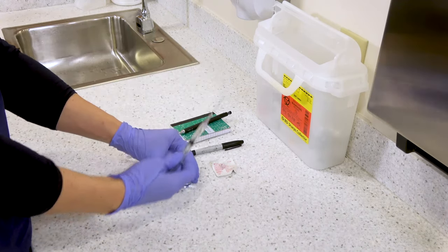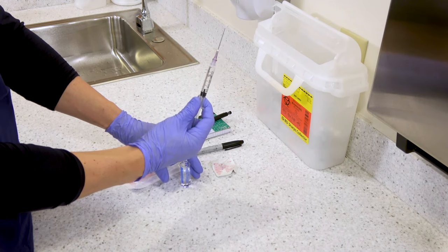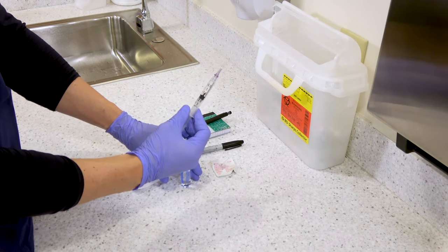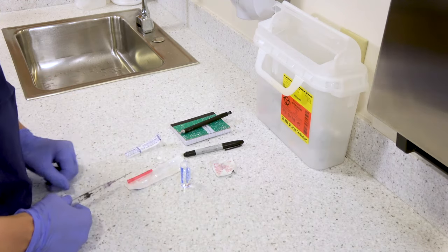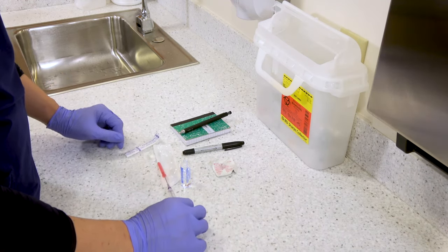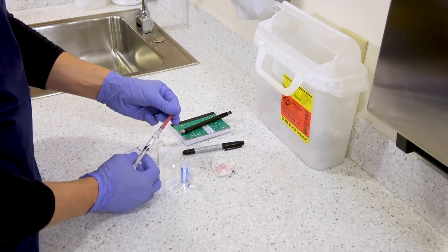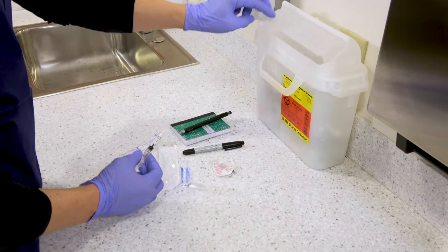You can invert it quickly and withdraw the fluid that way. Once you've got the amount that you need, you can safely recap your needle with the scoop technique, and then you'll want to remove the needle and dispose of it in the sharps container.